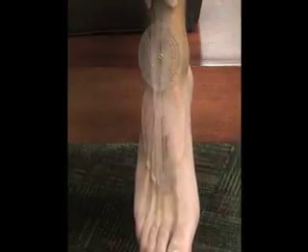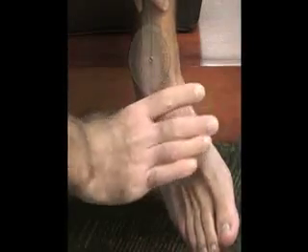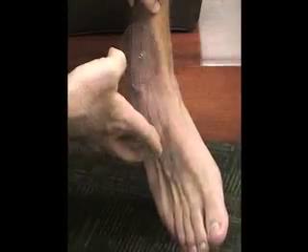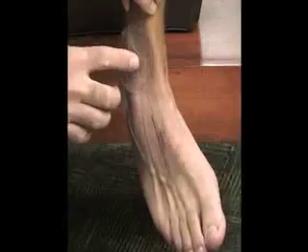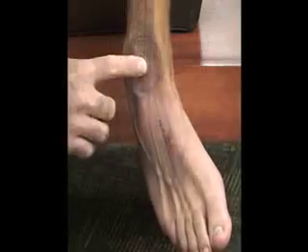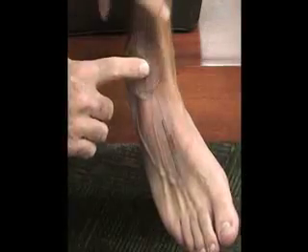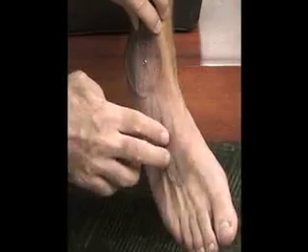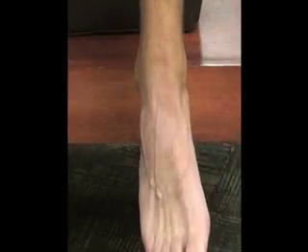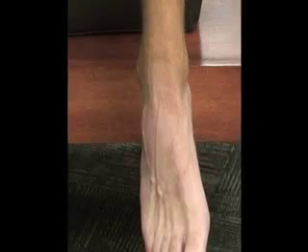The first one we're going to do is inversion. I'm going to have him stabilizing his knee and just moving into inversion. I'll make sure I maintain my landmarks up the center of the leg as well as down to the second metatarsal bone. Normal for this from the forefoot view is going to be 35 degrees inversion.